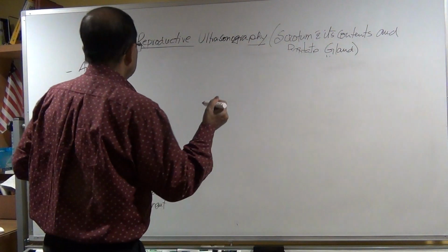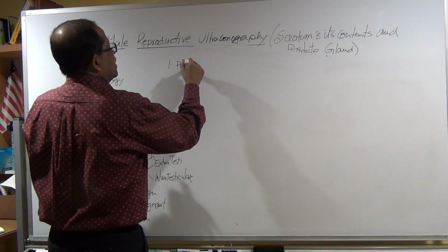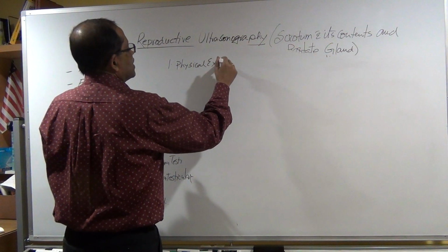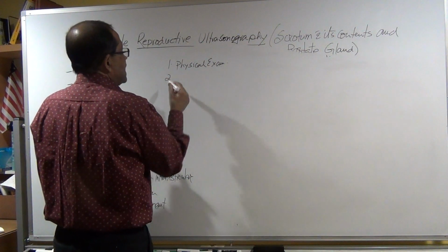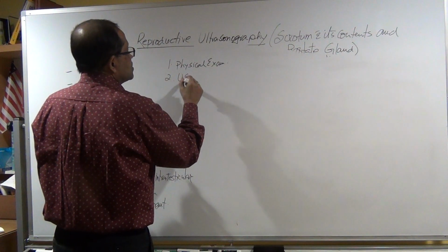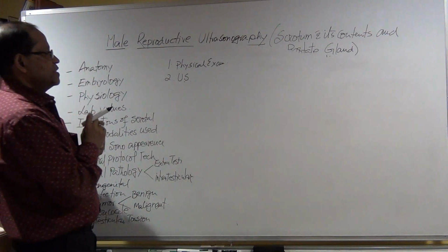So now, physical examination. After physical examination, the doctor will order the ultrasonography.